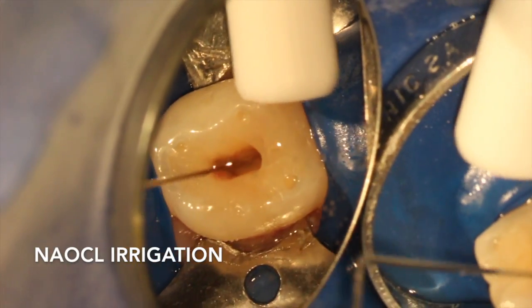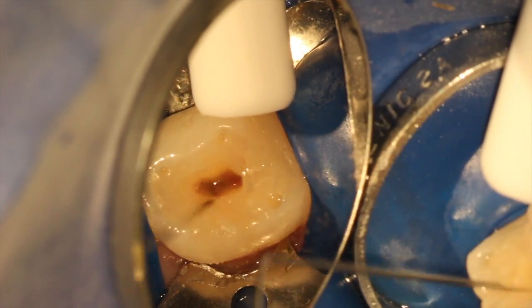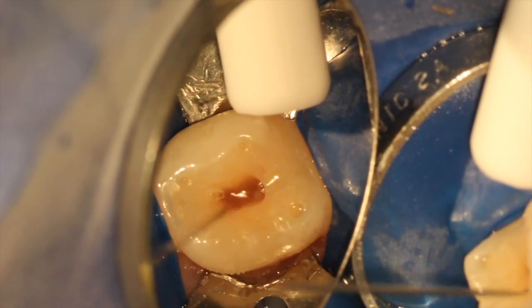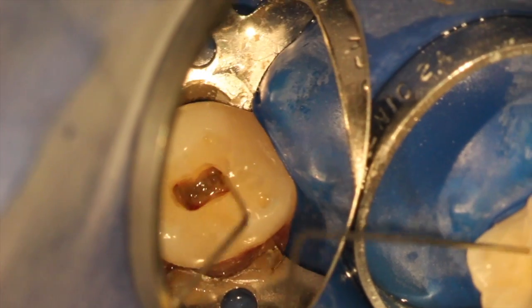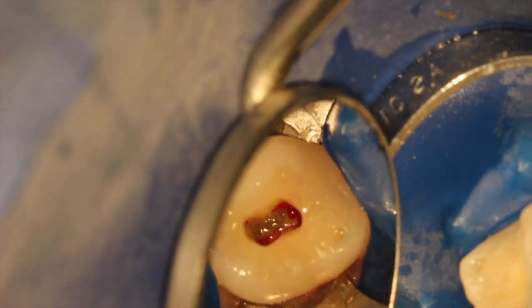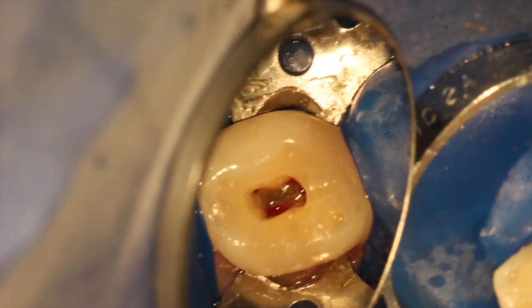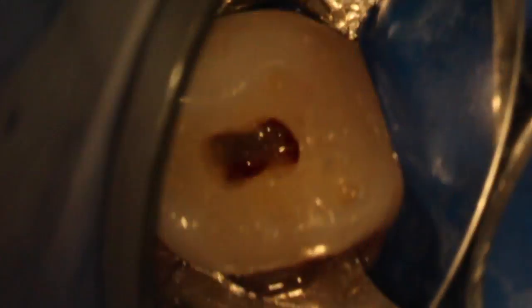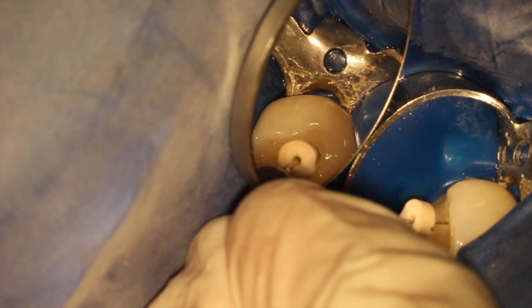The dentin is thinner on primary teeth, so we have to be very careful in our preparation. I use full-strength hypochlorite for disinfection, rinsing, and removing the tissue. I'll zoom in here in HiMag to show what that pulp chamber floor looks like — you can see a really tightly adhered pulp stone, and there's some bleeding around from the orifices.